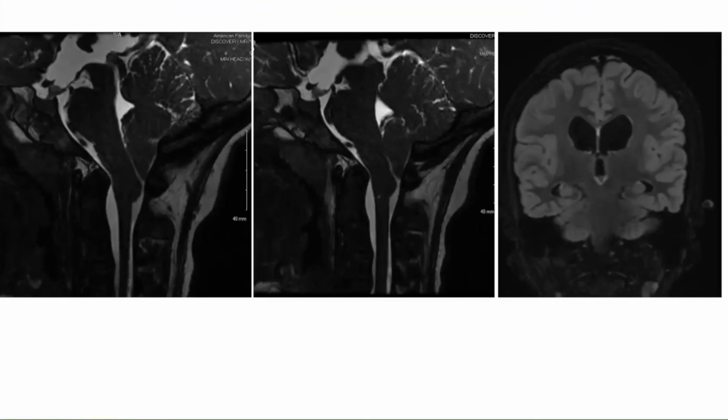It shows that she has ventriculomegaly. This scan actually shows that her aqueduct may potentially be blocked. There seems to be a lesion within the aqueduct, and what the radiologist pointed out as potentially a lesion in the third ventricle. In full disclosure, two radiologists were convinced about this.